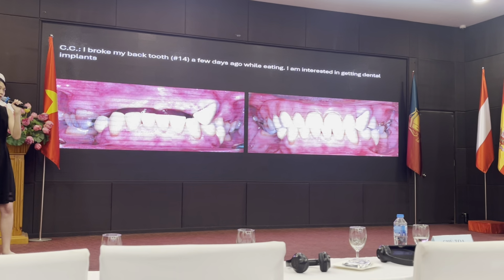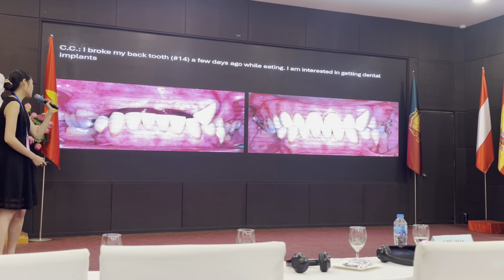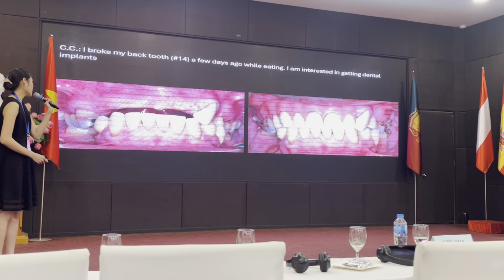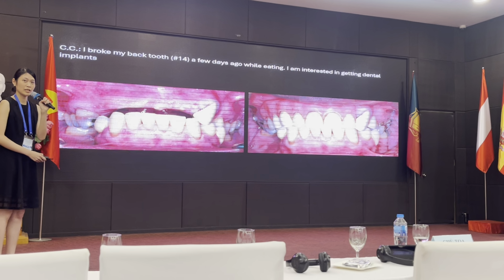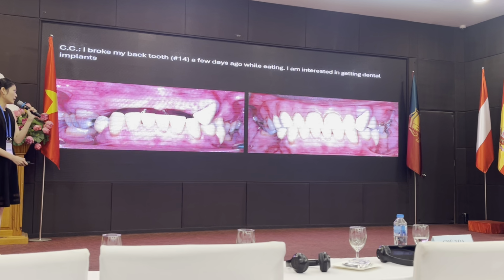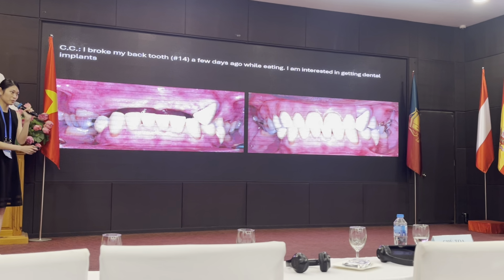Okay, and then the second case I would like to share is a full mouth rehab case. So this patient, he is from the Dominican Republic, and he mentioned that he broke his teeth a few days ago, and as you can appreciate here, he's wearing the partial denture. He only wears the top but not the bottom. And this is a metal-based partial denture here. And he wants to get the dental implants if possible.